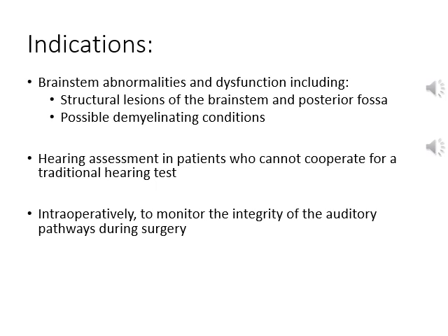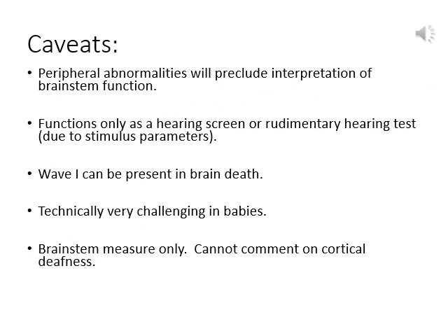Another indication for the ABR is within the operating room. The BAEP is used intraoperatively to monitor the integrity of the auditory pathway, especially as it passes through the brainstem and posterior fossa. There are some caveats to consider when interpreting the brainstem auditory evoked potential.